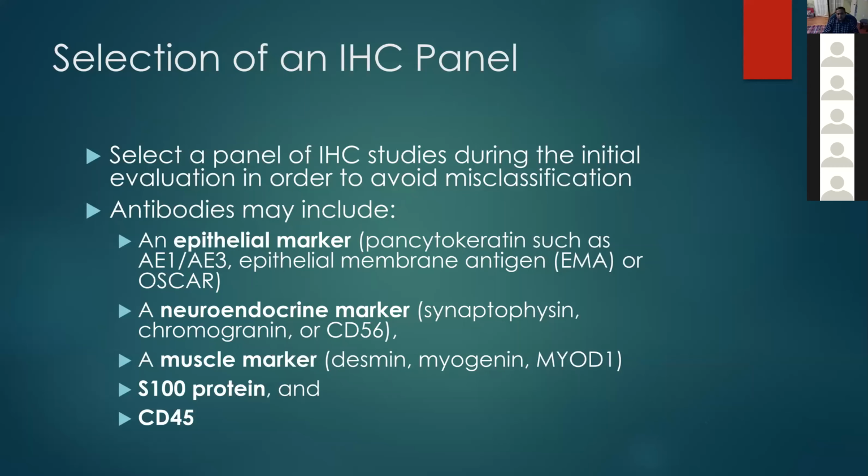All right, so now let's go to some specific tumors, okay? Look at the screen in front of you. You can see Ewing sarcoma. The most important marker is CD99, which is on the corner here. Or rhabdomyosarcoma, which you can see is positive for desmin, and also positive for myogenin. Then let's come to lymphoma leukemia, which will be positive for CD45.